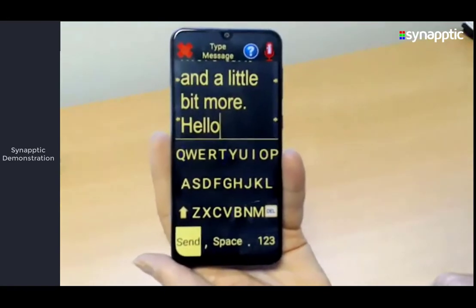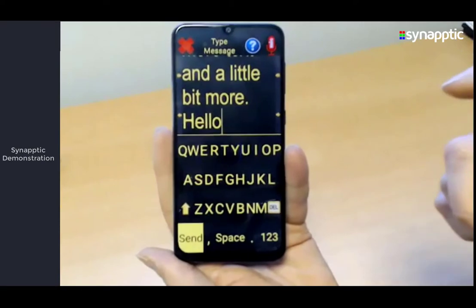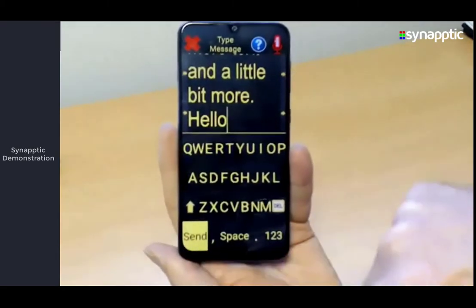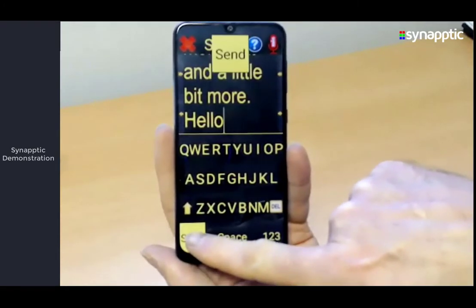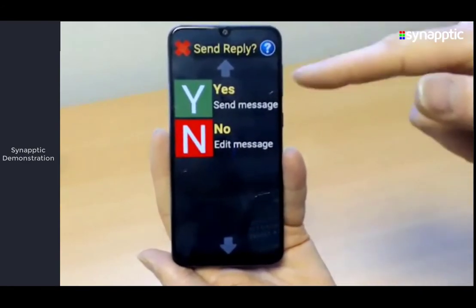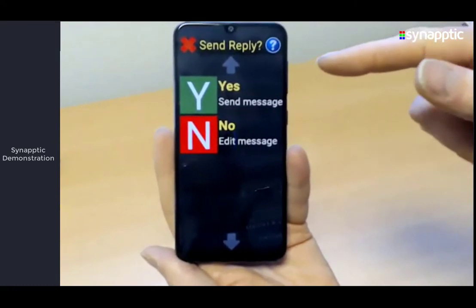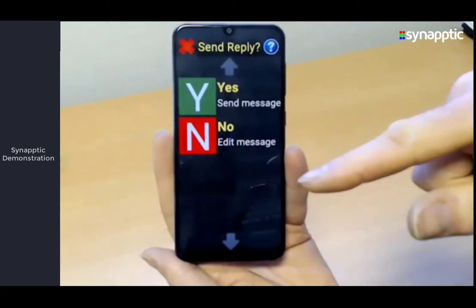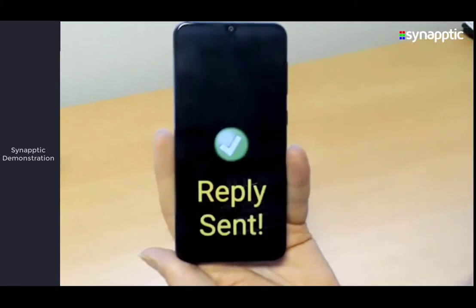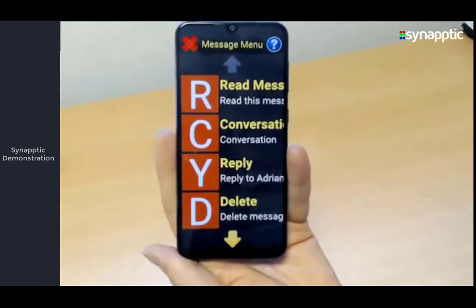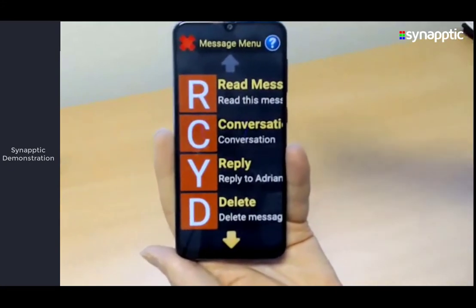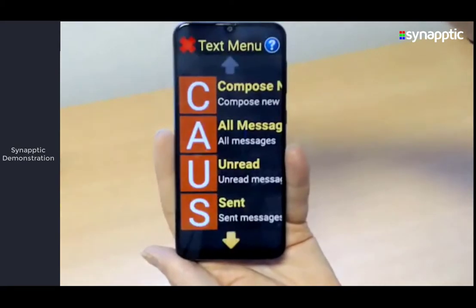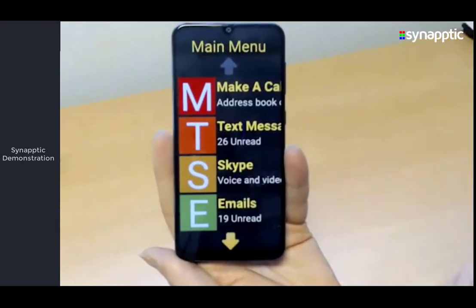When you're done and want to send the message, the action button applies — bottom left is this big yellow send button. It gives a little confirmation prompt so you can say yes or no, just in case you accidentally pressed send. We'll select yes — reply sent. My phone just beeped — the message has arrived. Then I cancel back to the text menu and main menu.